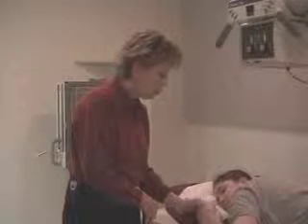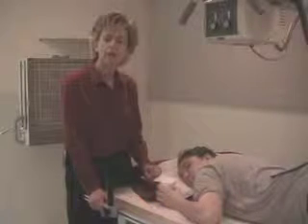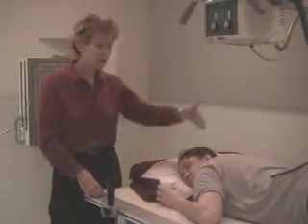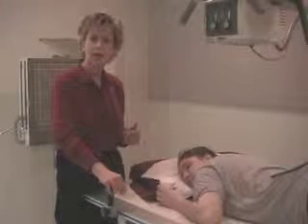The key is gaining patient cooperation. Explain that they need to keep swallowing large mouthfuls of barium. A recumbent position is recommended for esophageal studies because gravity assists the barium — in upright positioning, gravity moves barium faster, making it harder to capture. The patient can also be positioned vertically, but recumbent is preferred.